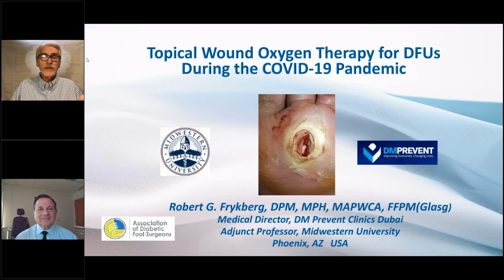And so HBO cannot be delivered in a home. It doesn't have the evidence that topical oxygen has, and this is ideally suited for what we're talking about right now. I'm sorry, that's a little bit long-winded, Matt, but it just goes to show how well suited topical oxygen therapy is to home-based therapies now, especially with telemedicine, as you mentioned, and the ability to use relaxed requirements for video conferencing and telephotos and imaging and everything. It's just perfect. I think you hit the nail right on the head.